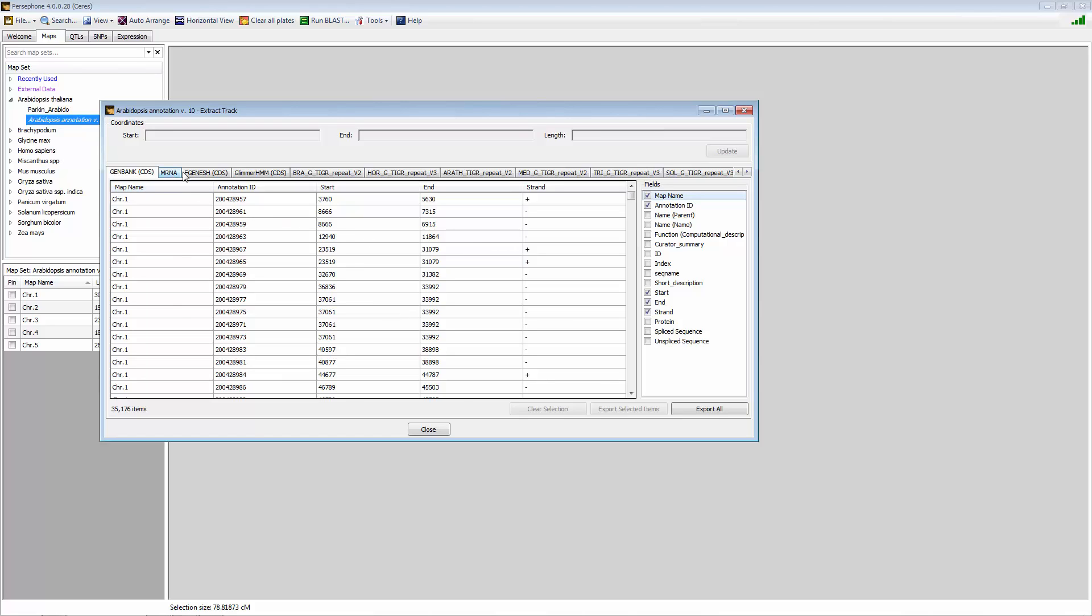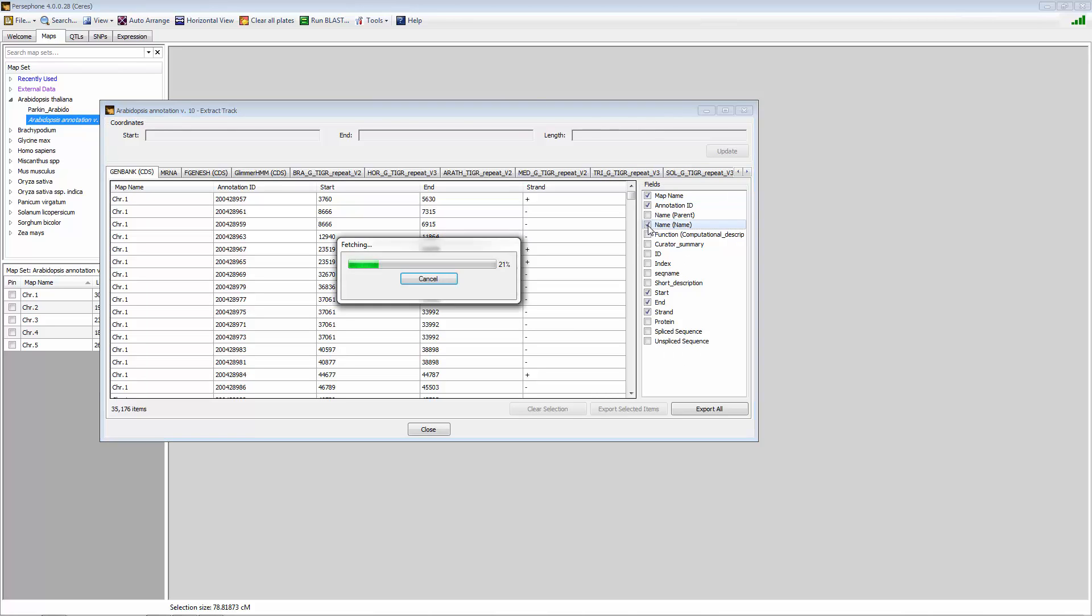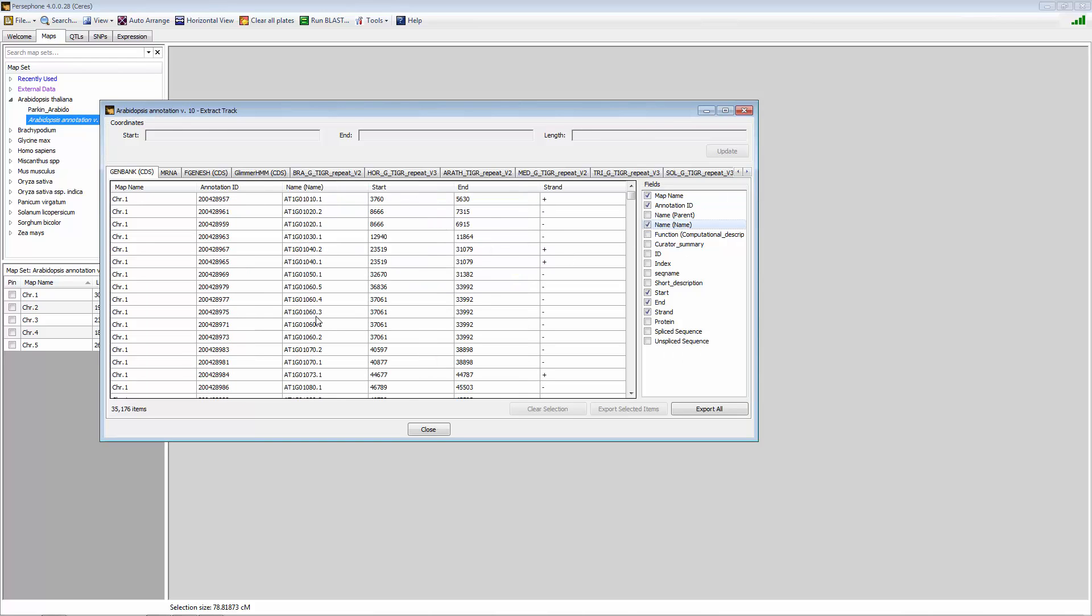This provides all the different tabs associated with that map set and provides all the different data that's captured in the database. And you can decide by clicking on and off which data you want to export for any given feature. Once again, this is an entire genome, and so this is all the genes on that entire genome under GenBank.